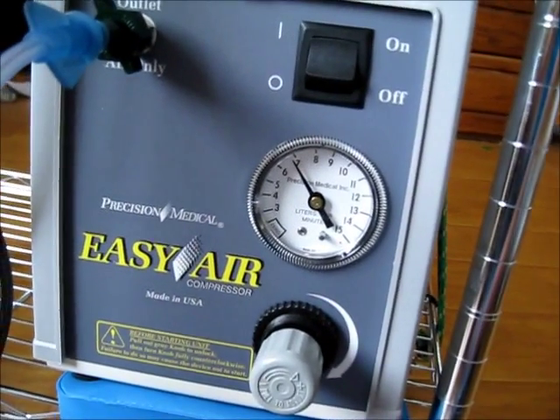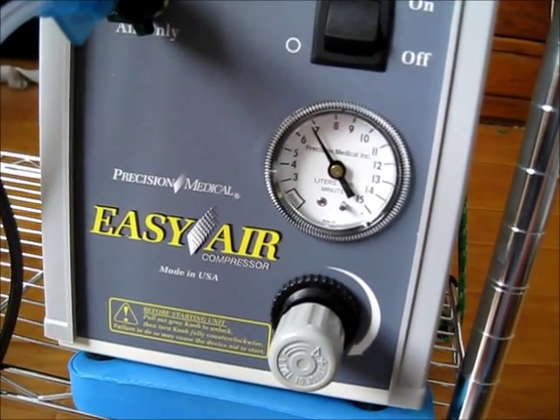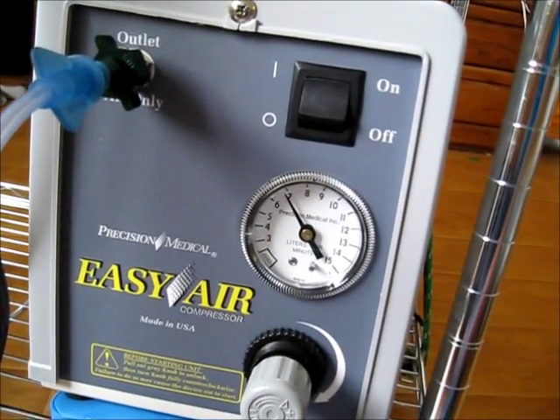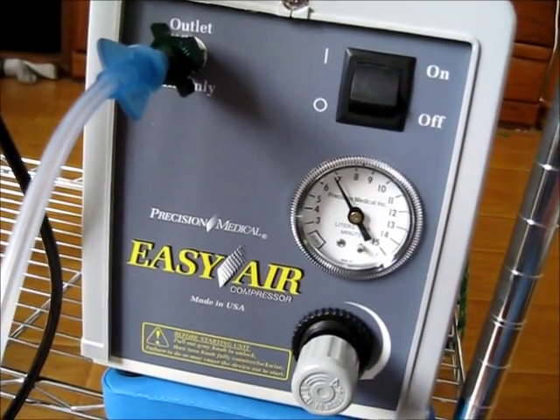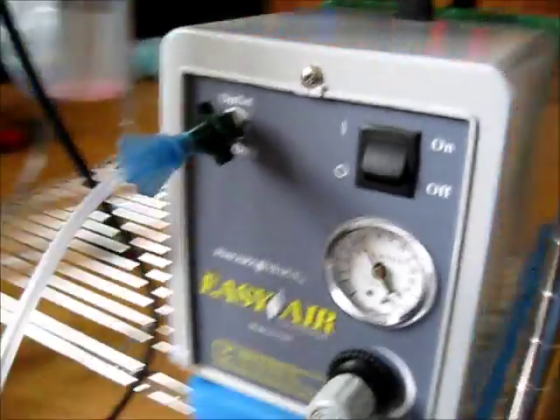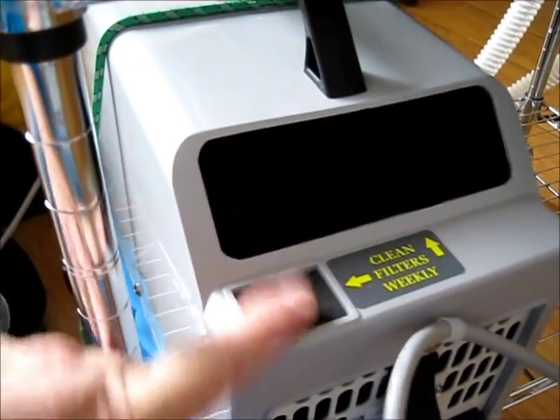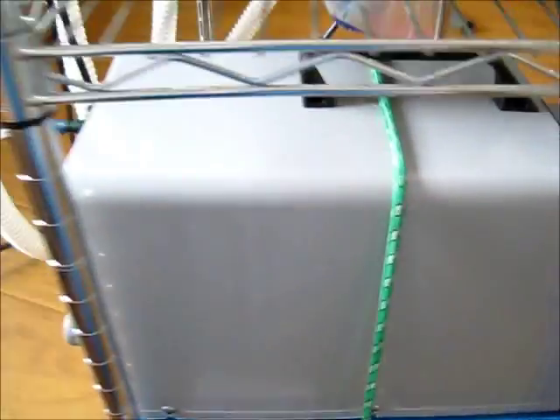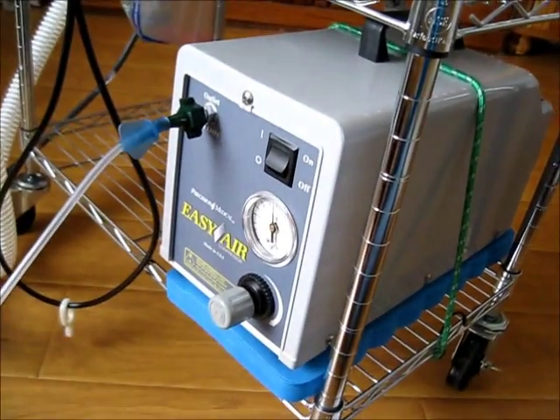Right now we're recommending the PM15F — the F, I believe, represents the flow gauge. It's about $585 to $600. Hopefully you guys can get your insurance to cover it. Wow, what a difference. The other thing about the machine is it does have filters in the back that they say to clean weekly — we're going to be doing a video on that soon. It's all encased, so the noise level is so much less. It's pretty rocking.